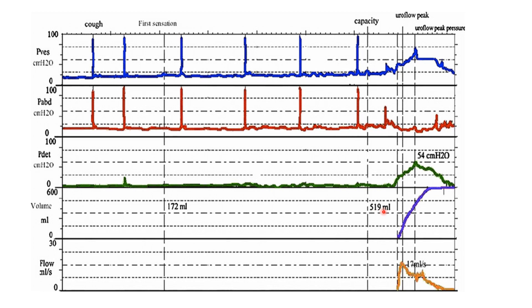The filling phase is now completed and the person is ready for voiding — this is the micturition phase. As the patient initiates urination, the pressure rises up to 54 cm of water. Abdominal pressure increased when the patient strained but returned to normal. The vesical pressure rose and then returned to normal. The voided volume in this patient is 600 ml. The flow is 17 ml per second as the average flow rate, which is within normal levels.